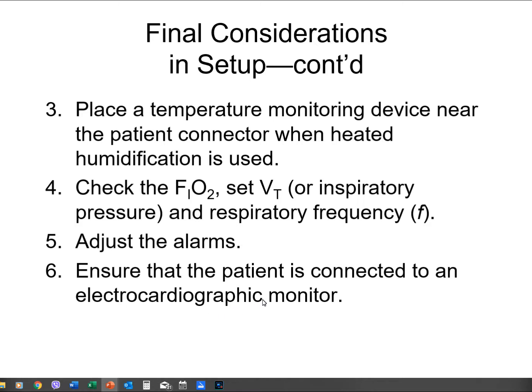electrocardiographic monitoring. So just make sure that the leads are on, because there are times where you're in the room, you're giving a treatment, all of a sudden it'll show that the patient's flatlined. And you look at the patient, might be sleeping, and you're sitting there like, holy cow, I'm going to call the code blue. You call the code blue, guess what? Everyone starts moving, there's banging, there's noises, the patient wakes up. What's going on? You're like, oh my gosh, I thought you're dead. But then one of the leads just came off. Save yourself the embarrassment. Check the leads first.